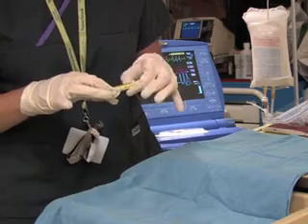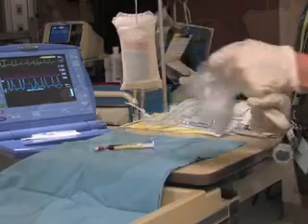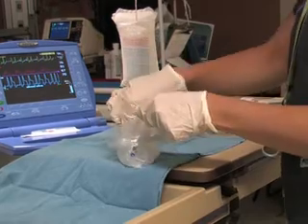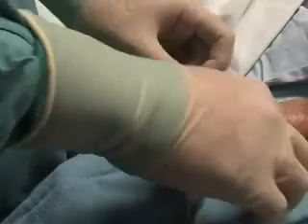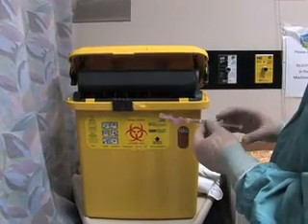Ensure that the syringe is labeled with the patient's name and unit number. Place the entire syringe in the bag of ice if transport to the lab is required. After pressure has been applied to the puncture site for 5 minutes, affix the gauze with some tape. Dispose of all sharps in the designated sharps containers.